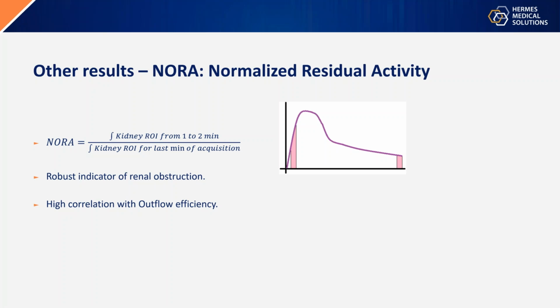So we in Florence have been using for 40 years a method very similar to the Patlak plot to obtain about 50,000 absolute monolateral functions and an equal number of transit times. The question is how the UHR low energy collimator, the ultra high resolution low energy collimator, versus the all-purpose high resolution, affects those measurements.